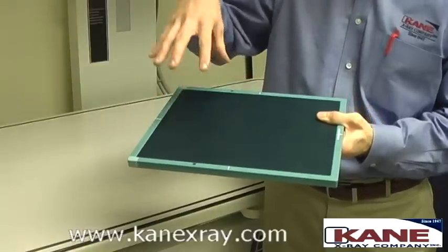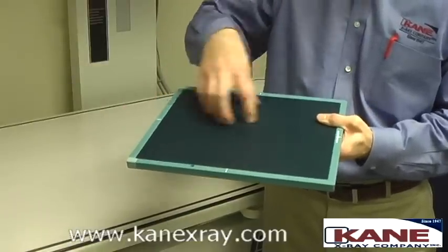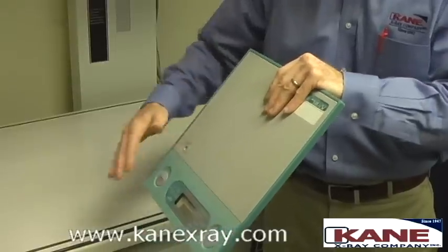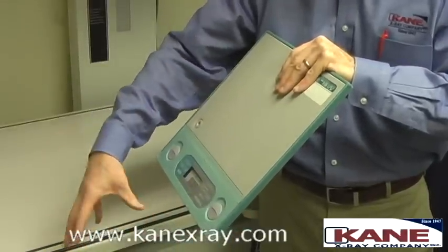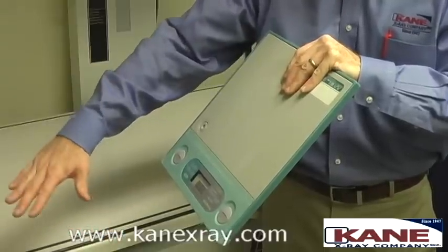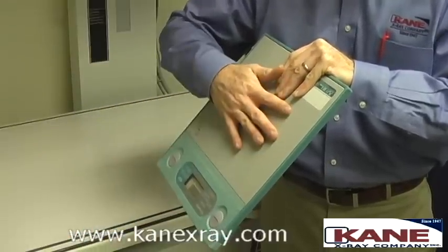However, in digital imaging, when these cassettes are hit with radiation, those crystals stay in a charged state until we feed this cassette in the scanner unit. It extracts that imaging plate, and then those crystals are hit with a laser, and then they glow. That image is read digitally, and then the imaging plate is erased for reuse and fed back in the cassette for multiple exams.